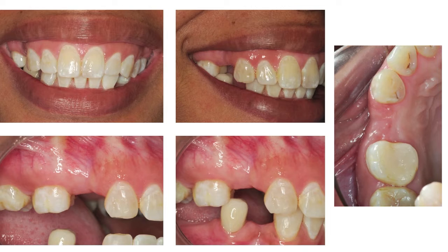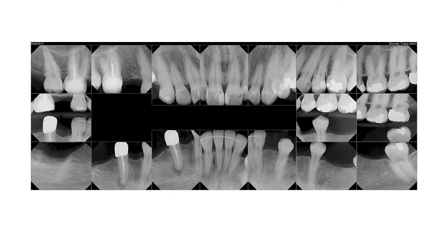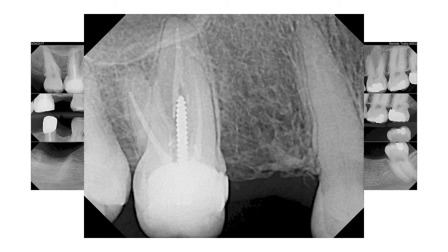So Tidra's missing several teeth, but we're going to treat just one. Okay, here's what her teeth look like. The teeth are apparently sound. You see, she's missing tooth number 5 in the maxilla. She's missing multiple mandibular teeth. But what we're going to do is treat this tooth.